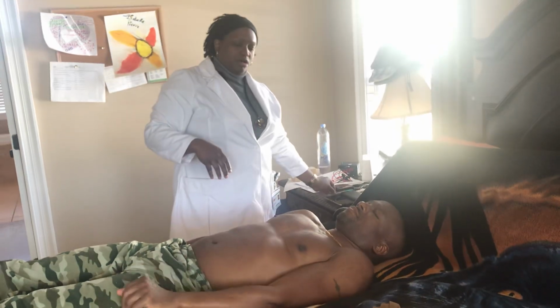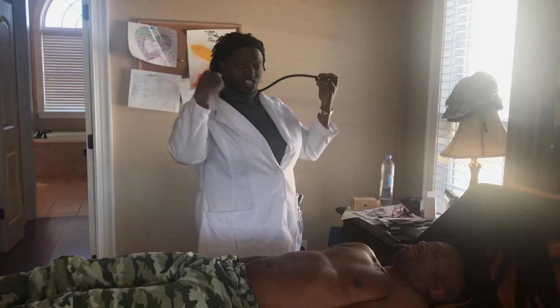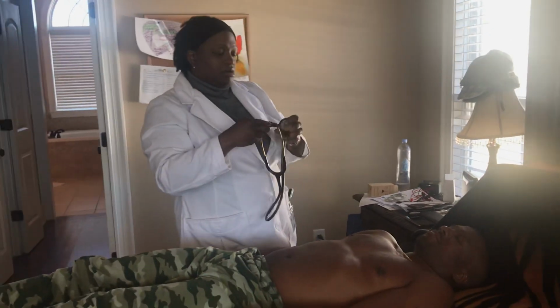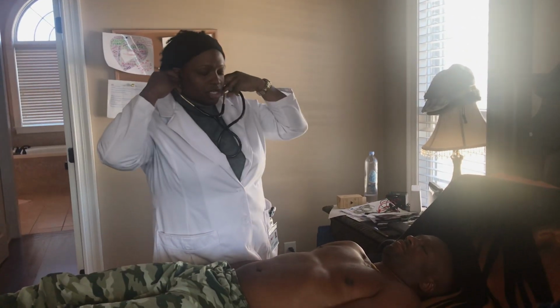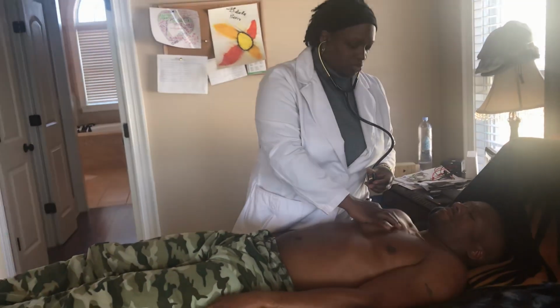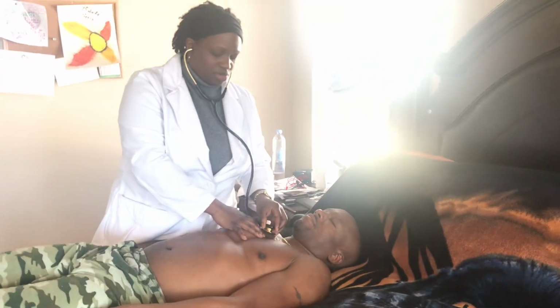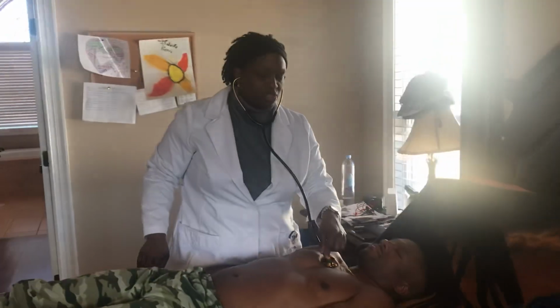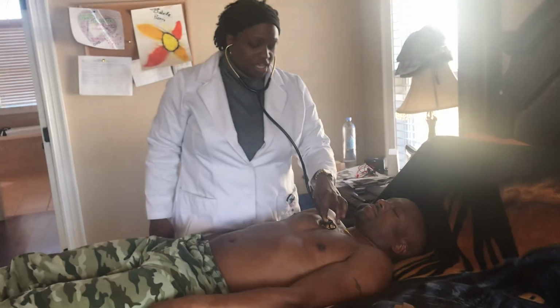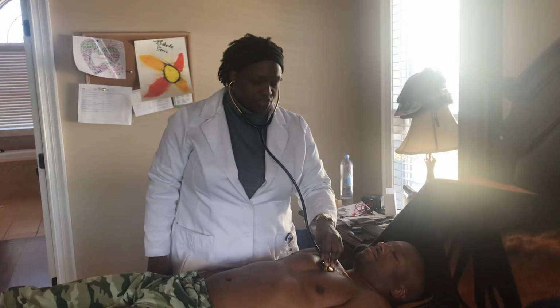Okay. The next thing I'm going to do for the cardiac assessment is actually listen to his heart. So I'm going to listen to his heart with him lying like this first. The first thing I'm going to do is listen to the right sternal border, second intercostal space. This is going to be the aortic region. This region is best to listen for the aortic valve.